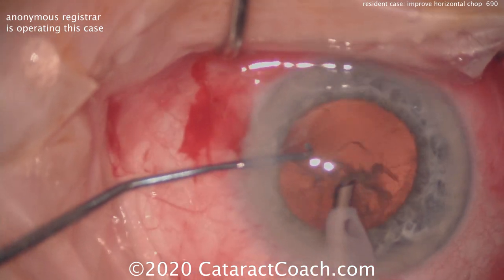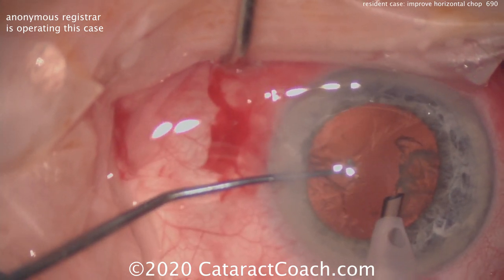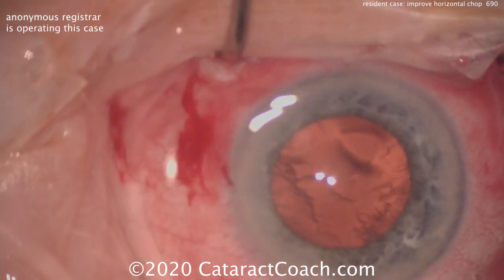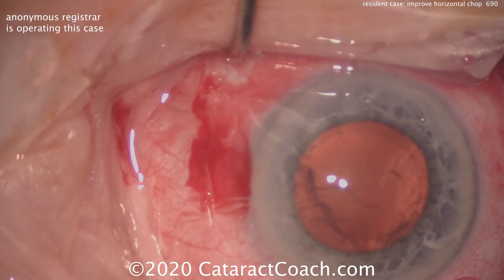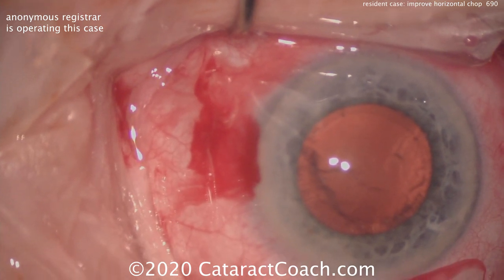As a result, there wasn't a strong hold or purchase on the nucleus, and when the surgeon went for the chop it wasn't a complete chop. The two halves didn't fully separate — the crack, or the chop, between the two pieces didn't propagate all the way through.